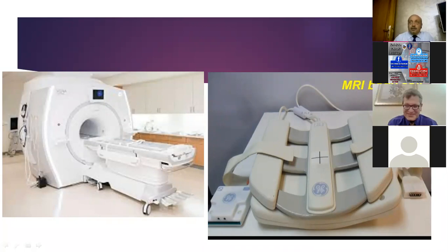Inside the tube, there is also a magnet and the radio frequency machine, which transmits the radio frequency impulses through this MRI coil. This is the coil, which is placed between the magnet and the patient on the table. This coil transmits the pulsations, which are received again from the patient to make the photo.